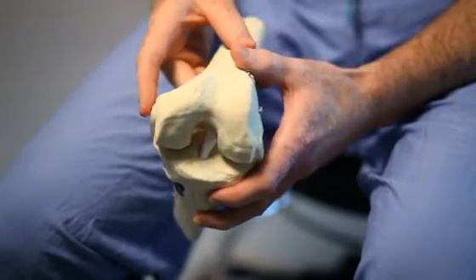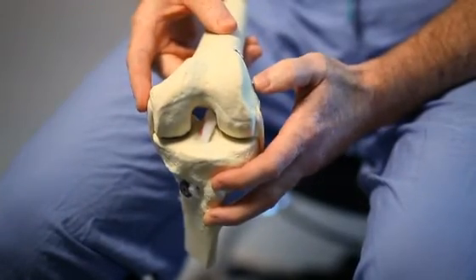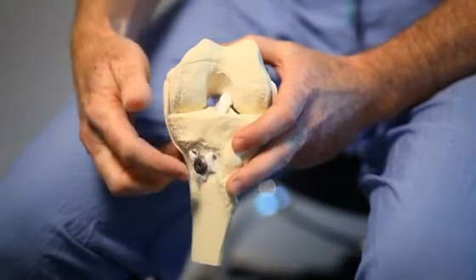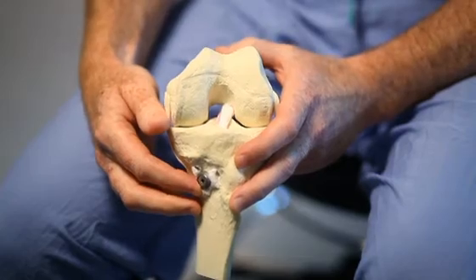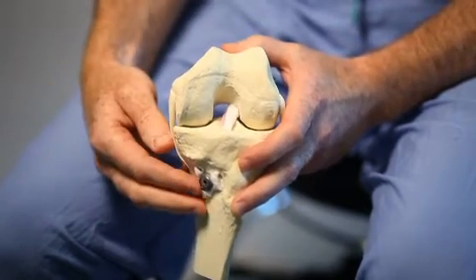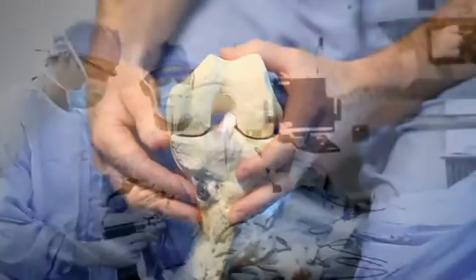When we pass them we use little buttons on the outside to help secure them into the bone, as well as a little screw on the bottom to help secure that to the bone. This prevents the ligament from moving until it's healed. The material is meant to last a lifetime.